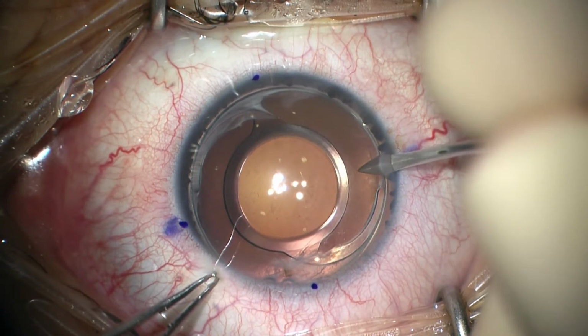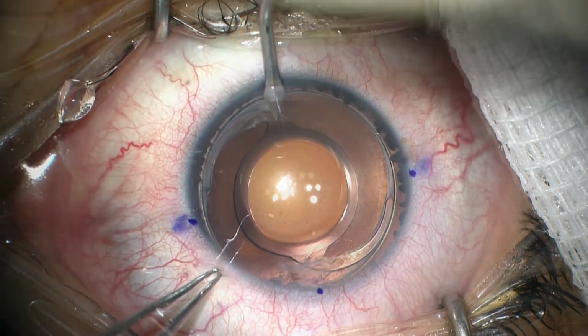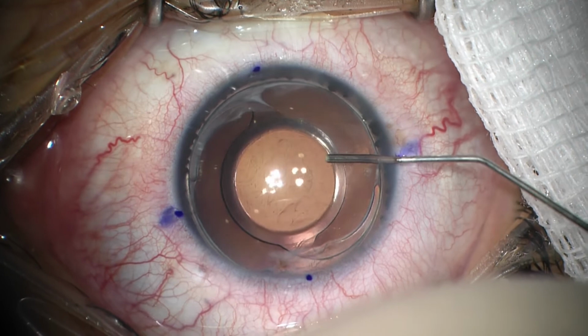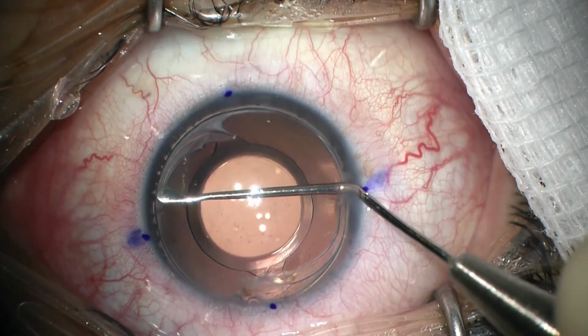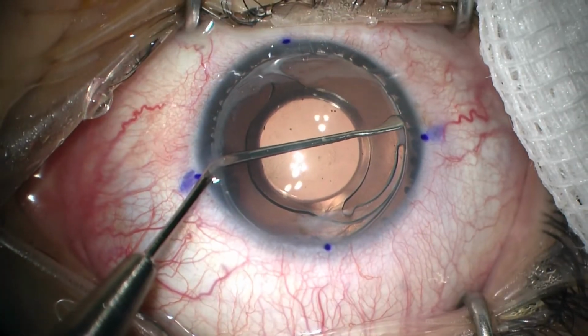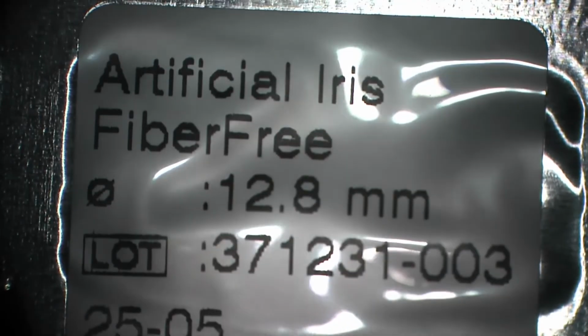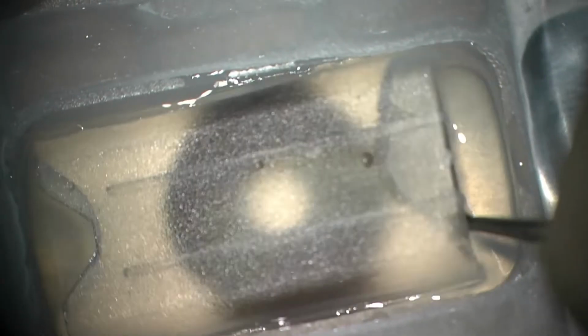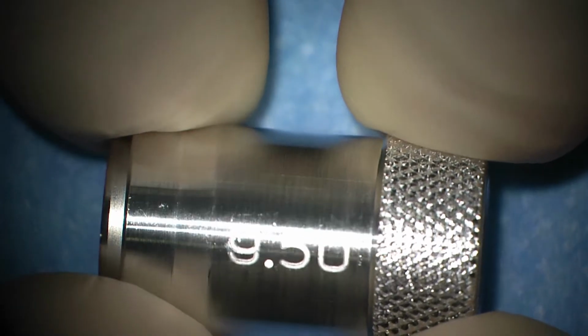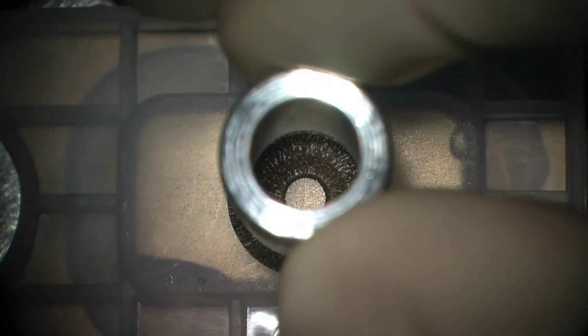Perform three auxiliary paracenteses. Inject cohesive viscoelastic. Open the capsular bag with a blunt spatula using the three paracenteses. Take the Custom Flex artificial iris, fiber-free, out of the container. Select a 9.5 mm trephine. Cut the artificial iris to the desired diameter.